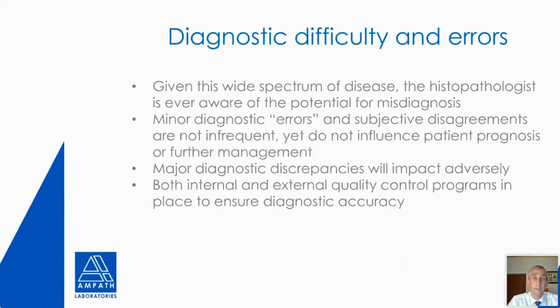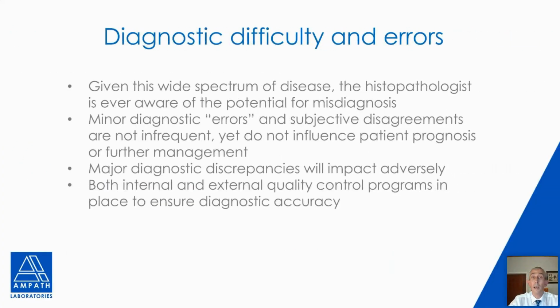Concerning diagnostic difficulty and errors, given this wide spectrum of disease, we are ever aware of the potential for misdiagnosis. Minor diagnostic errors and subjective disagreements are not infrequent, and these do not influence patient prognoses or further management thereof. However, major diagnostic discrepancies will impact adversely, and in order to ensure diagnostic accuracy, we make use of regular internal and external quality control programs.